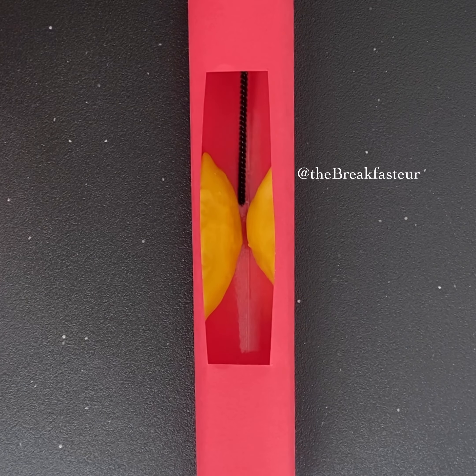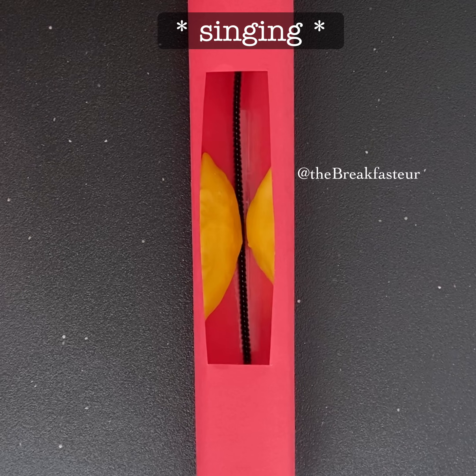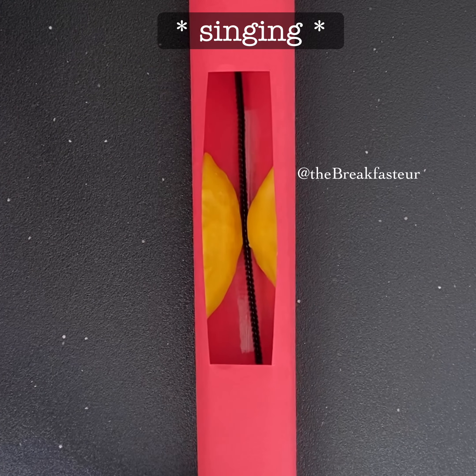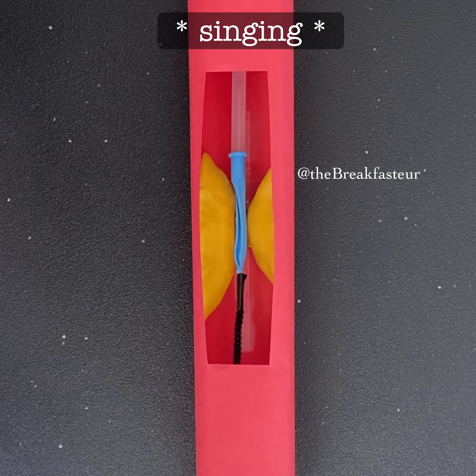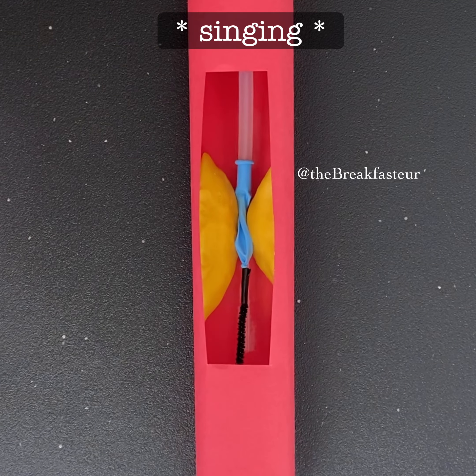It's fat, and it's also called plaque. We're putting our wire through the plaque, and over the wire we're going to push a catheter with a balloon on the end, and then we're going to inflate the balloon.